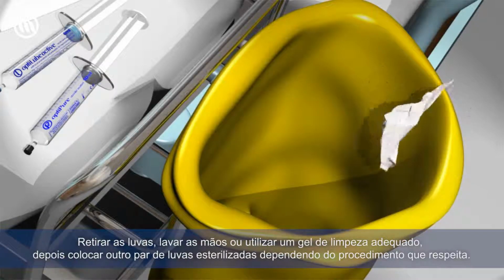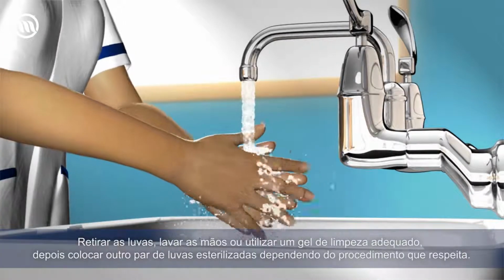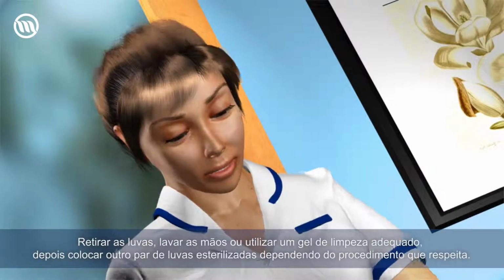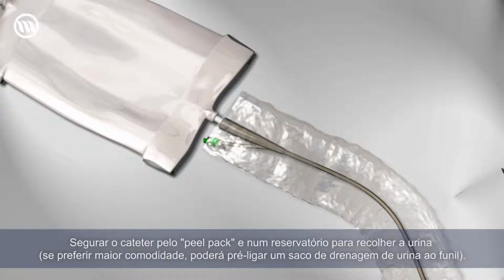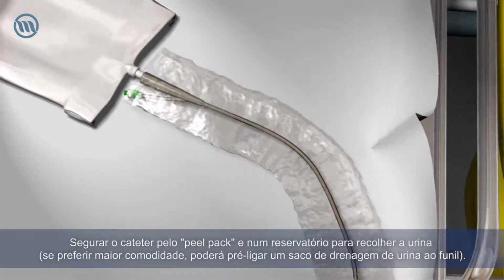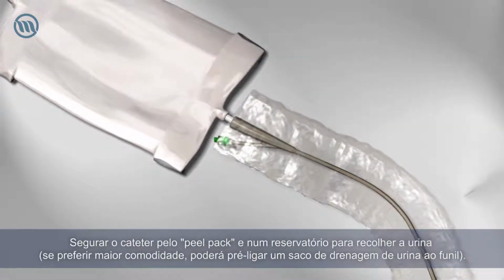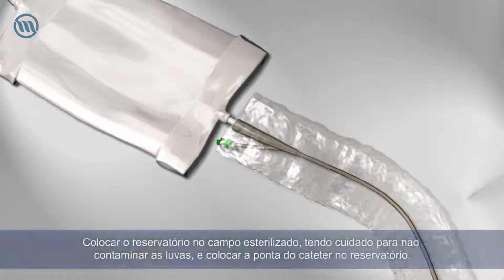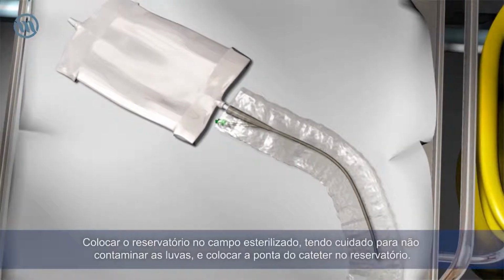Remove the gloves. Wash your hands or use a suitable cleansing gel. Then put on another pair of sterile gloves, depending on which procedure you follow. Take hold of the catheter in its plastic sleeve and container to collect the urine. A urine drainage bag may be pre-connected to the funnel for convenience if preferred. Place the container on the sterile sheet, taking care you do not contaminate your gloves, and place the funnel end of the catheter in the container.